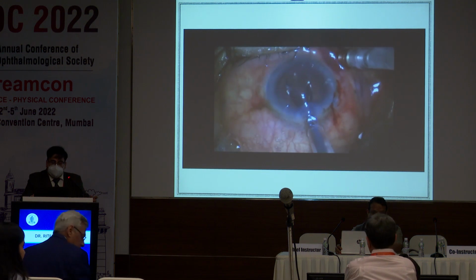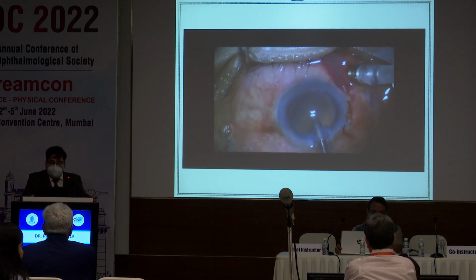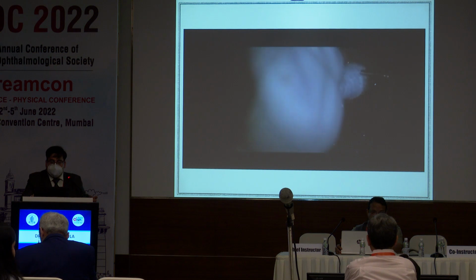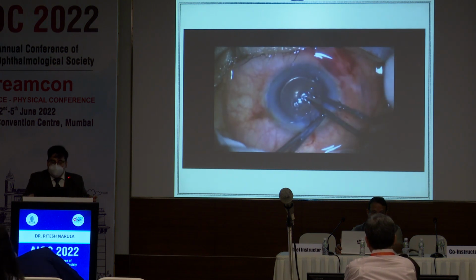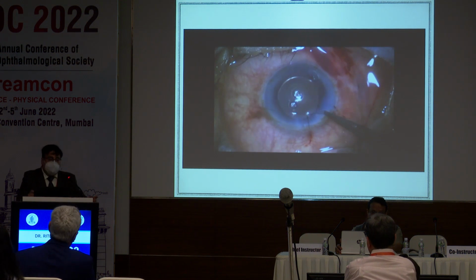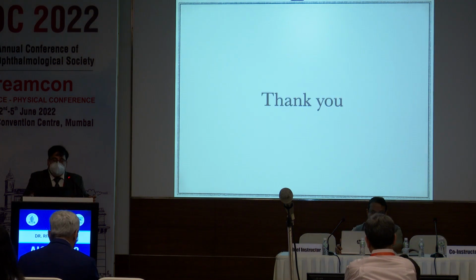And that's the surgery being completed, the IOL being inserted and the wound secured, and in the end the trocar is just removed with a slight pressure onto the port. So in a tricky situation, with the help of a trocar cannula system and vitreous decompression, one is able to carry on these surgeries in a much safer and more controlled manner, without any risk of complications. Thank you.